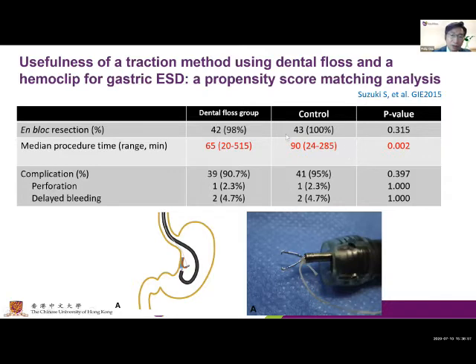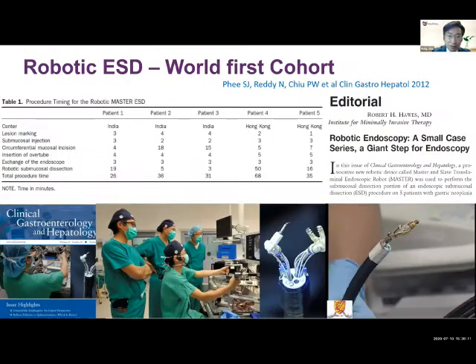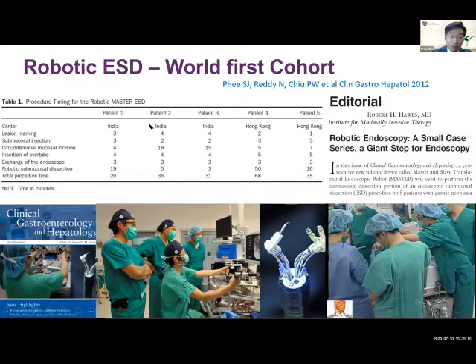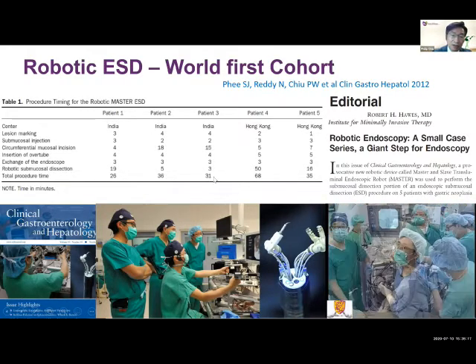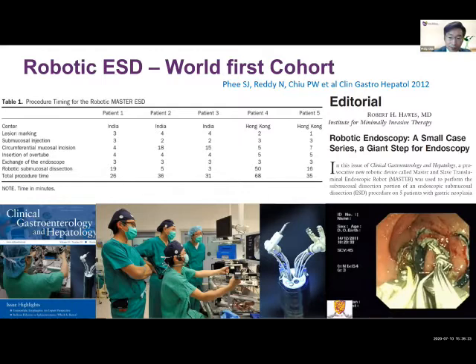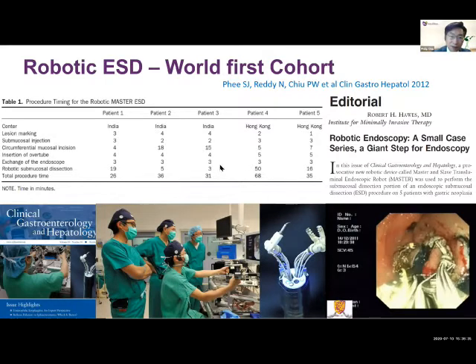And in a reported study, the dental floss group had a shorter operative time as compared to the control without this retraction. And I think you probably also know that in collaboration with the National University of Singapore and also Nanyang Technological University, we developed the robotic master technique for performance of the ESD.